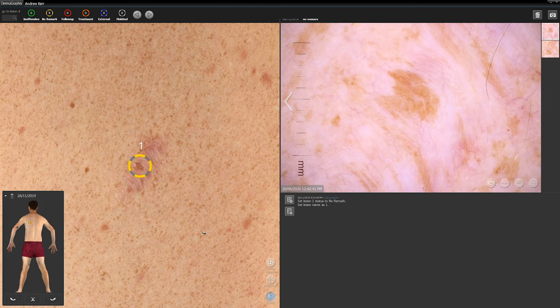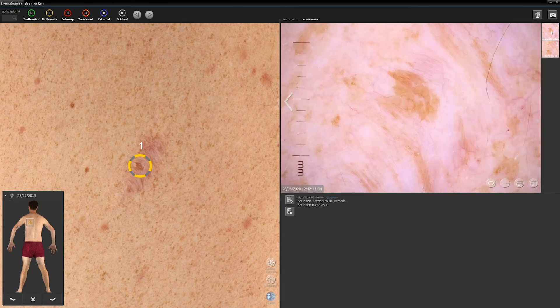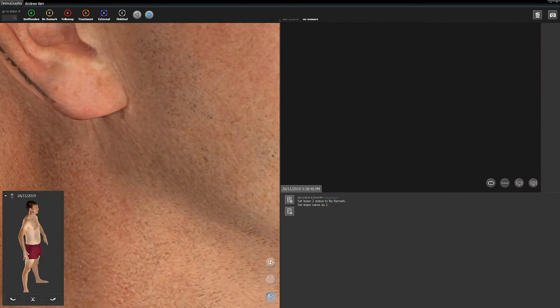This will open the dermoscopy image. In some cases, previous dermoscopy thumbnails will be present in the top right corner of the screen, representing previously captured dermoscopic images of the lesion. These can be viewed by clicking on each image. To view all captured dermoscopic images, use the navigational arrows to move through the lesion numbers and view the associated dermoscopic images.